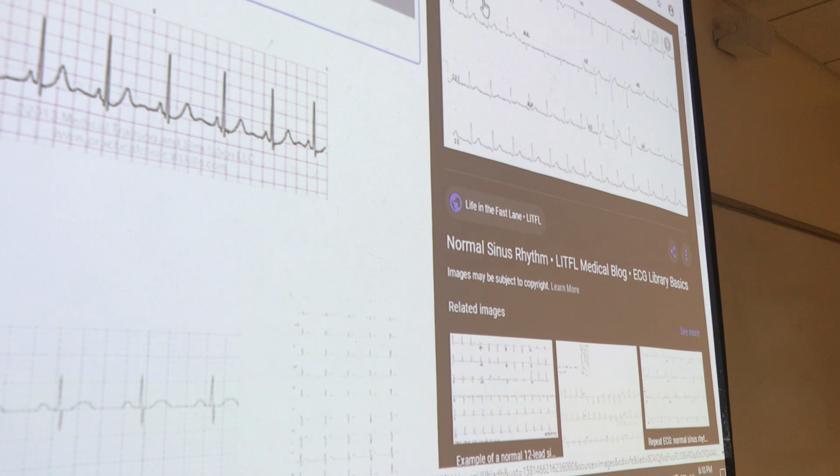When we do the ECG today, we will have some leads, some electrodes, on your legs and arms. We only have a 3-lead electrode system. When you go in to get your physical, you guys are young, so you might not have this yet, but if you're like me, every year they want to see if your heart is fine. So 3 leads, 3 electrodes, is not good enough. What they'll do is put more electrodes on. We want complete 360 coverage of the heart. So then if there's any issues at all, we can see.